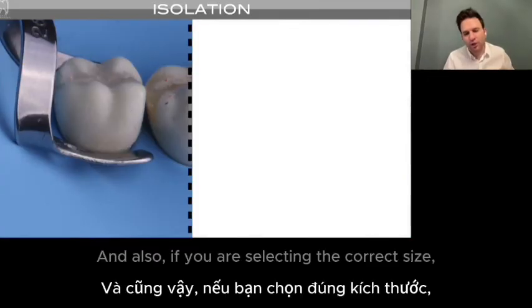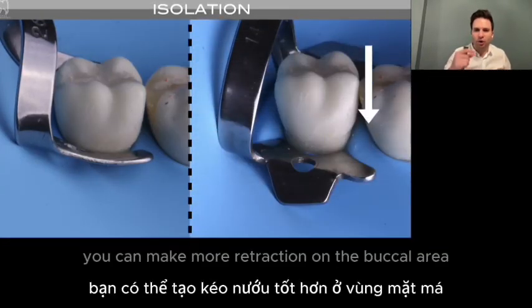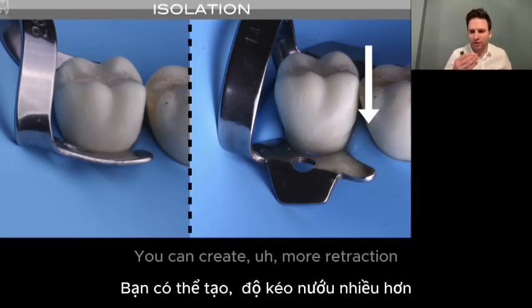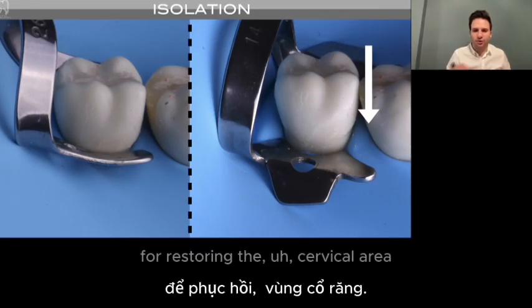And also, if you are selecting the correct size, you can make more retraction on the buccal area of the tooth, especially for cervical abrasion. You can create more retraction for restoring the cervical area.